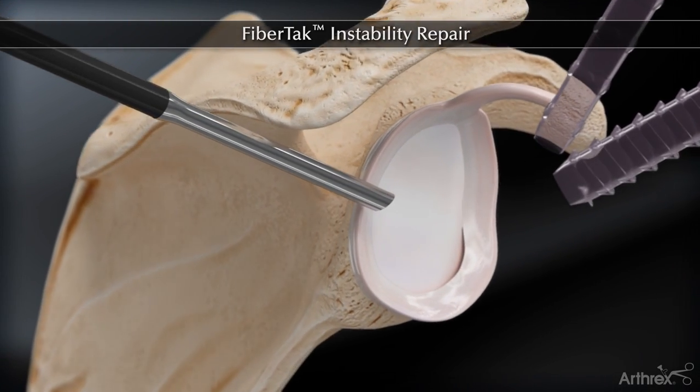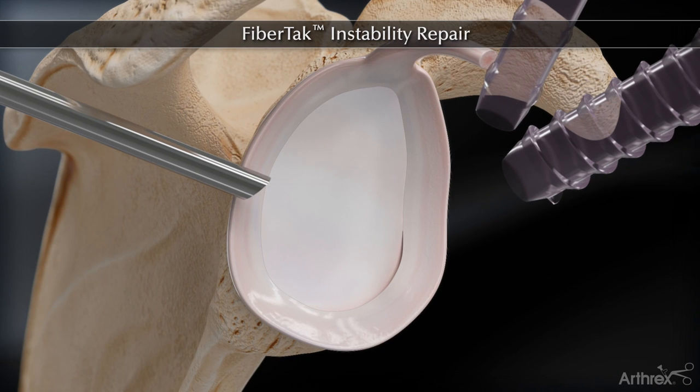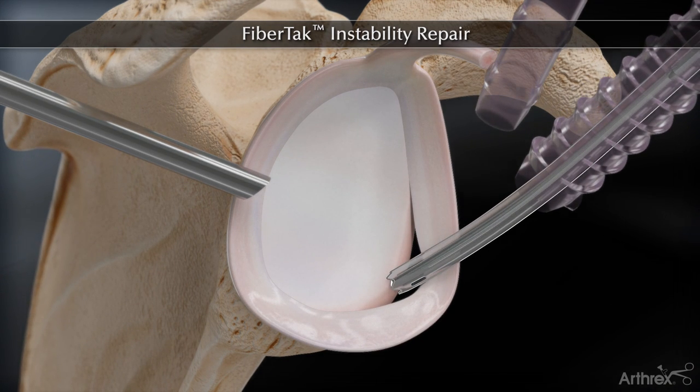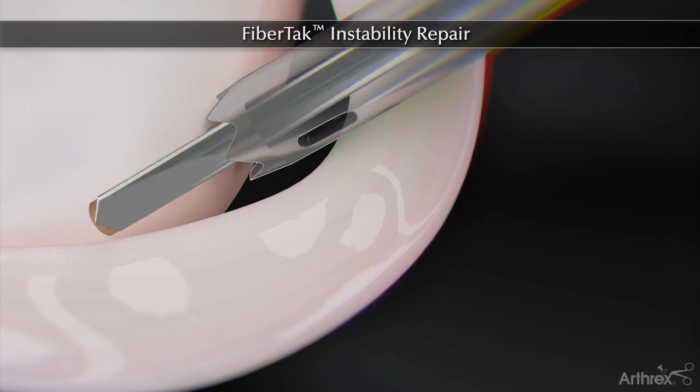The bone bed is prepared and the curved spear is inserted percutaneously or through a cannula. The bone socket is drilled.